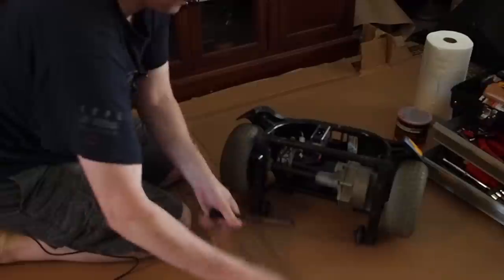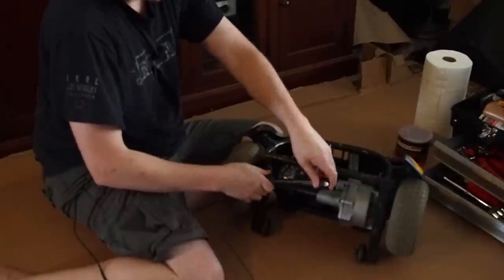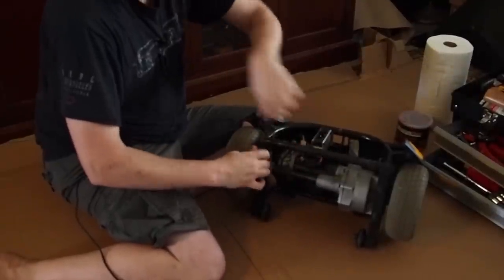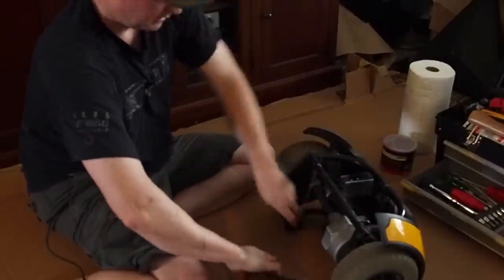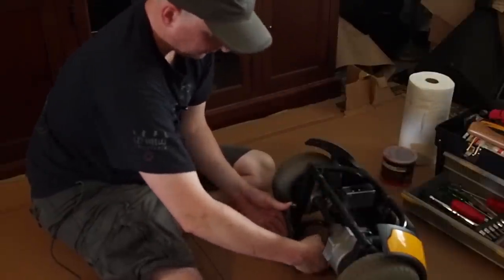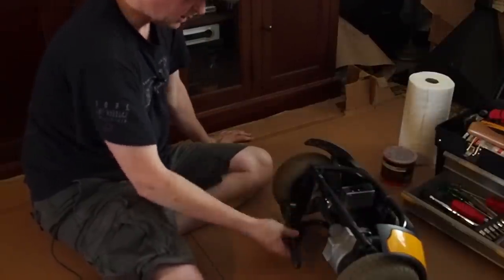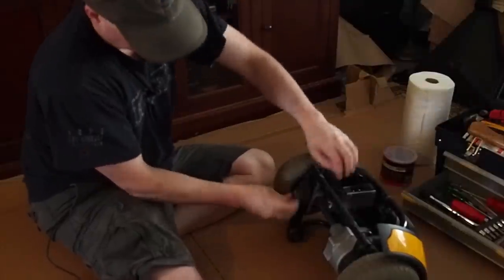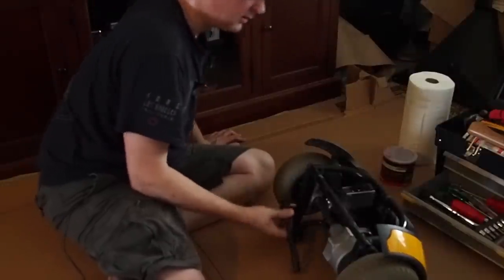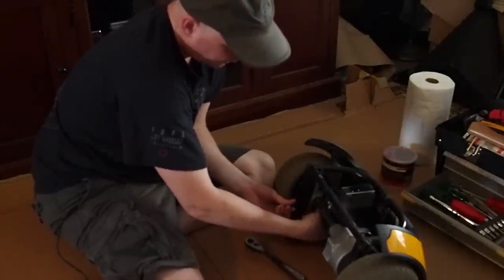So let's just start. So one of the things that, as you see, I did here is, well, first of all, I have an Allen wrench on the back side because these bolts go all the way through, and I can't just do the bolts without the Allen wrench. But as you see here, I'm sitting on cardboard because this is a lot of mess. So, and I probably should disconnect all of the other pieces first prior to doing this, but.